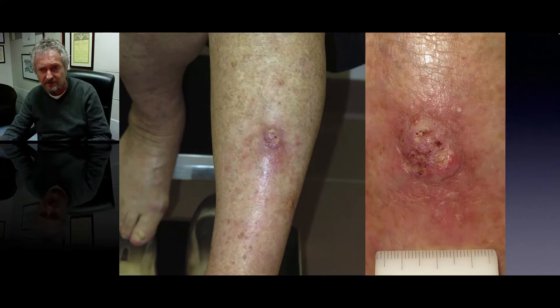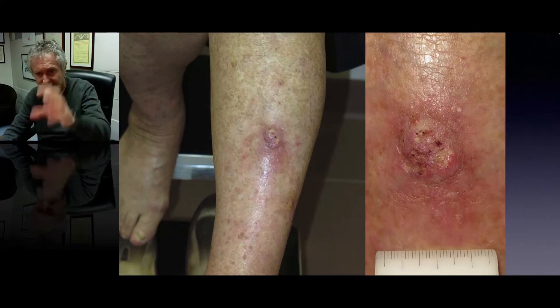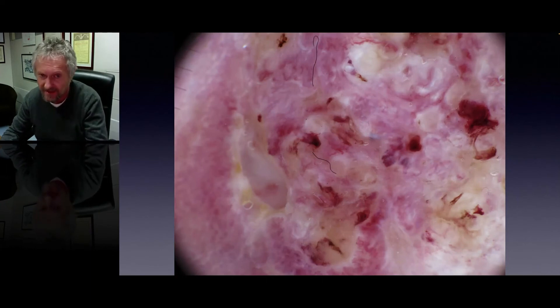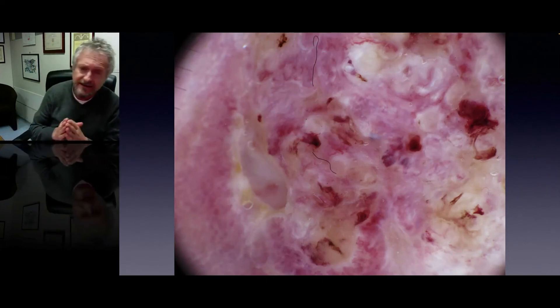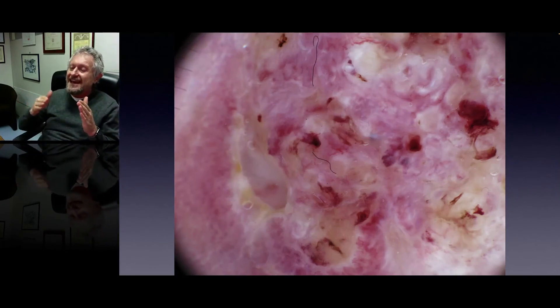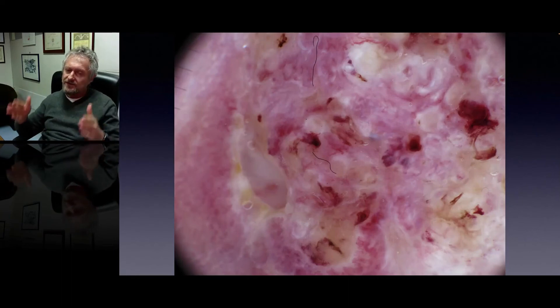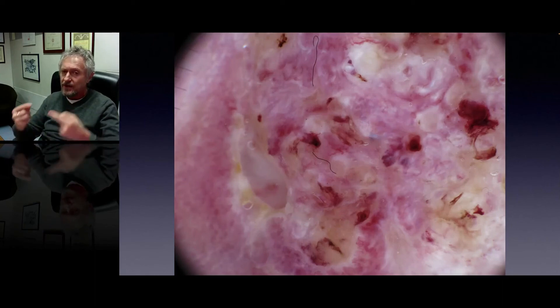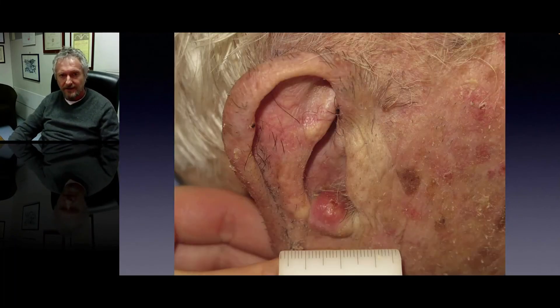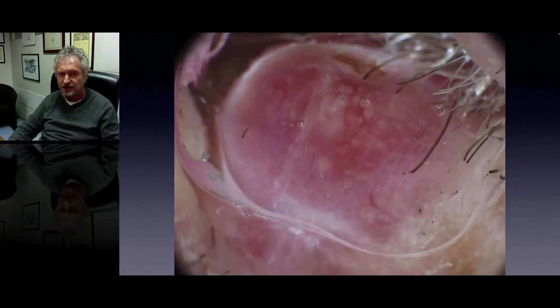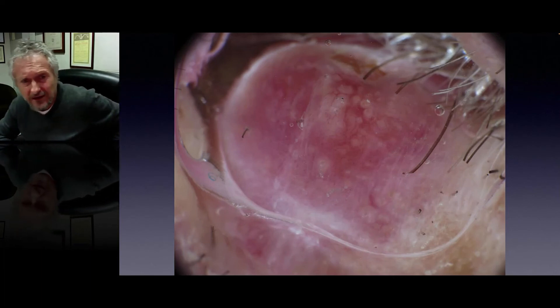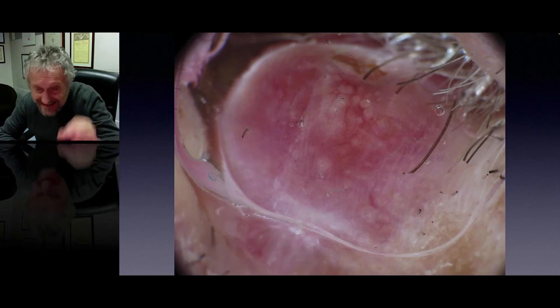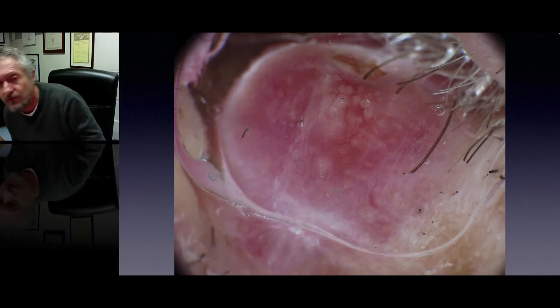Here is another example of a squamous cell carcinoma — a nodule with scales and ulceration clinically — showing a combination of white color but also a lot of red color and polymorphic vessels. When SCC is well differentiated, you have a lot of white color; as you move toward poor differentiation, you see less and less white and much more red. In a poorly differentiated squamous cell carcinoma, white color is not so visible; we see a red tumor with some white circles still present as a clue.